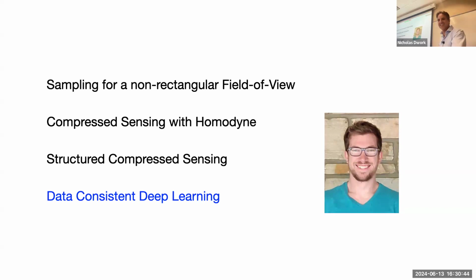Yeah, I have a question about the central core piece of it. If you're doing parallel imaging, in principle, you don't actually need a fully sampled central core. If you use fully sampled, is it necessary? That's a good question. It depends what you mean by parallel imaging. If you're using, for example, GRAPPA, you need some fully sampled center region, right? If you had sensitivity maps, then you don't. So then you could accelerate even further.